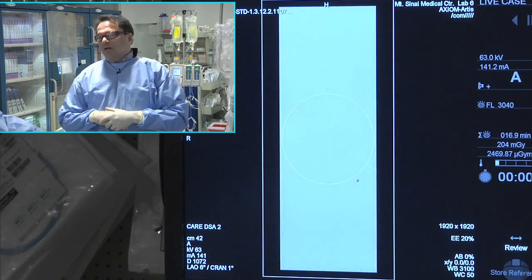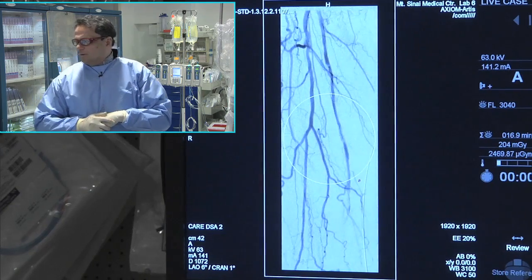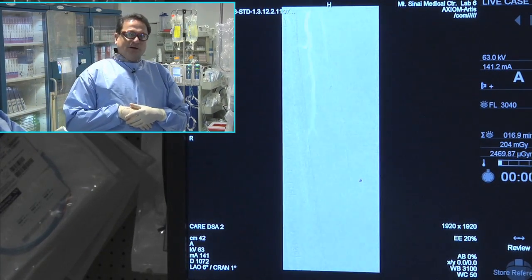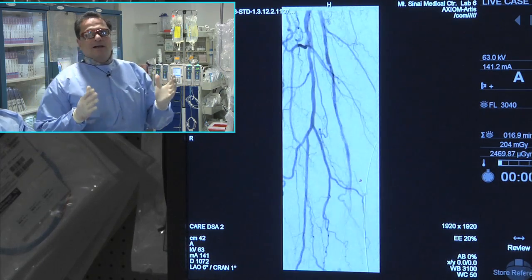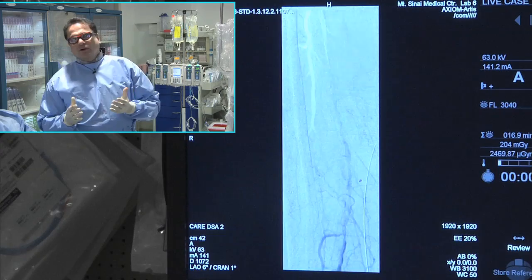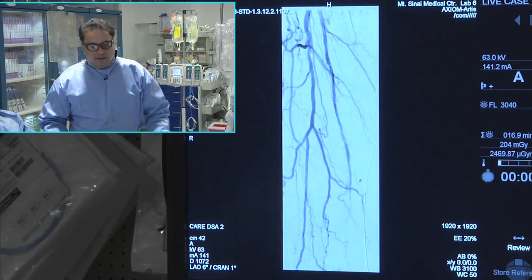I don't remember the average lesion length in Supera 500. Do you remember? It's like 20. What was it? 14. So 14. Supera 500 average lesion length was around 14. So again, it's not quite as long as what we're discussing, but clearly there were lesions that were longer than this that were involved in that. So Supera could be another option.